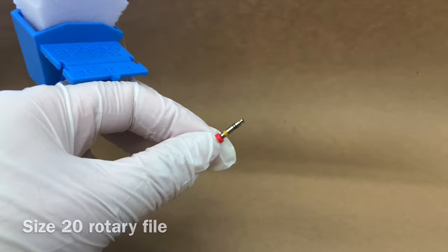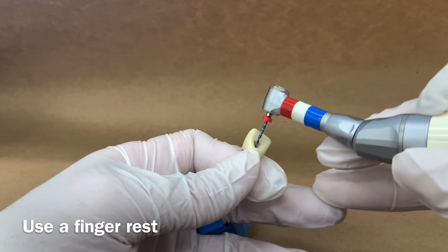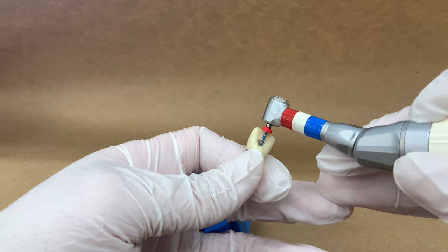Repeat these steps using the size 20 rotary file. Remember to use a finger rest, which can be on a neighboring tooth. Here I am just using my other hand as a finger rest because the tooth is not mounted.